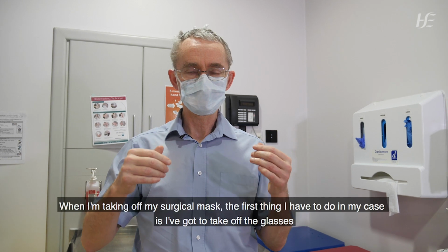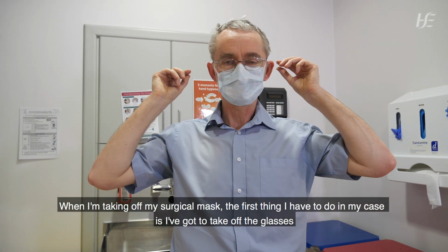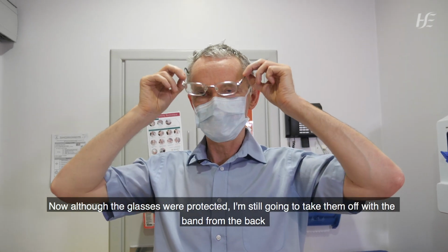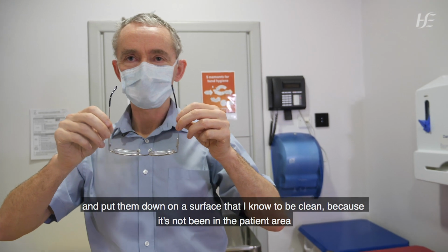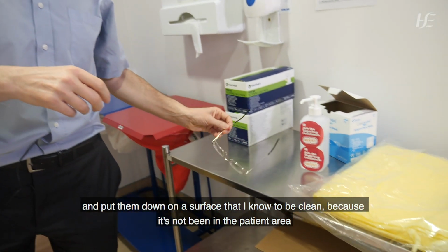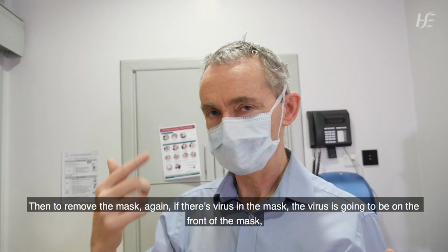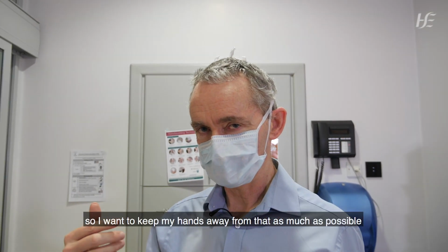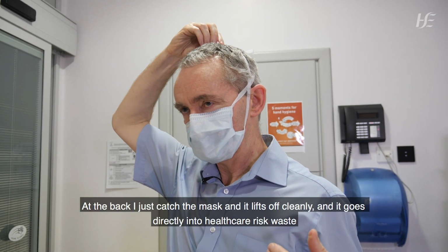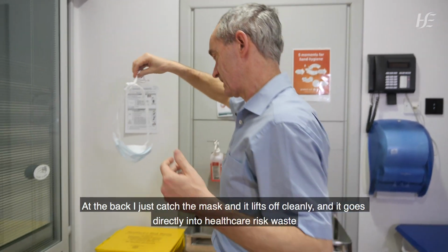So I'm taking off my surgical mask. Well, the first thing I have to do in my case is take off the glasses. Although the glasses were protected, I'm still going to take them off with the band from the back and put them down on a surface that I know to be clean because it's not been in the patient area. And then to remove the mask, again, if there's virus in the mask, the virus is going to be on the front of the mask. So I want to keep my hands away from that as much as possible. So at the back, I just catch the mask and it lifts off cleanly and it goes directly into healthcare risk waste.